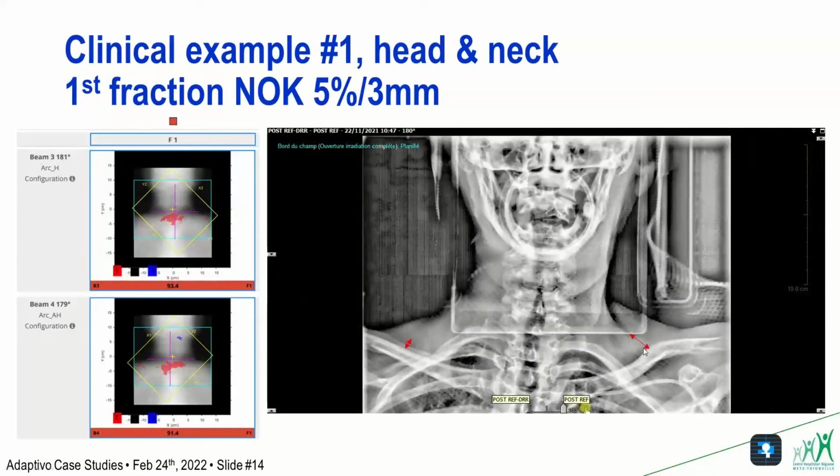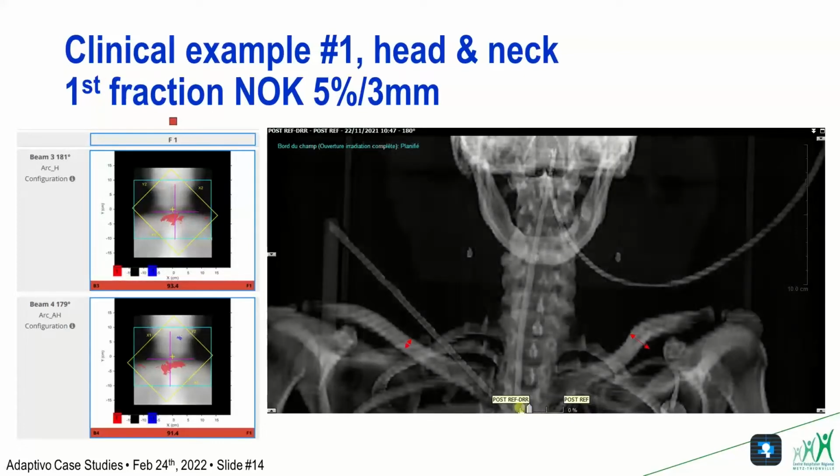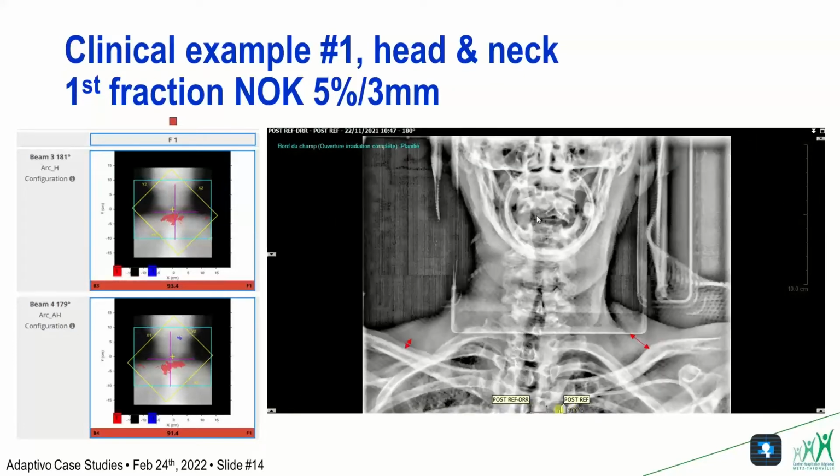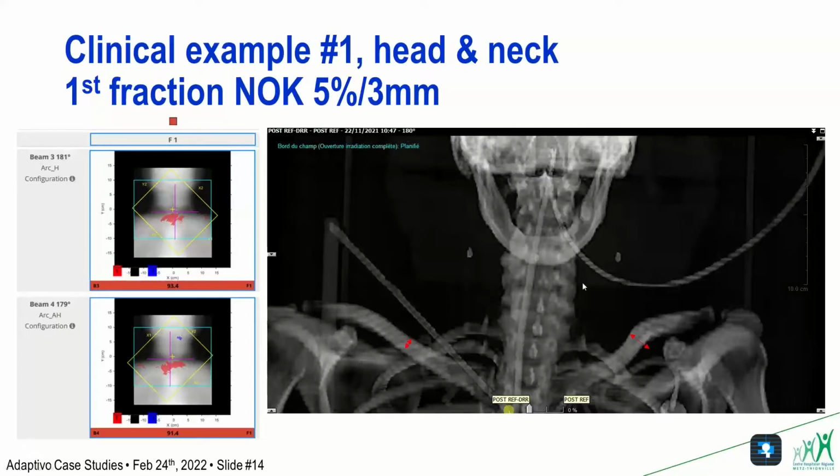the shoulder, the clavicle positioning is actually not correct. We did not see it because I think that our therapist was focusing on the spine positioning. So we did the treatment.